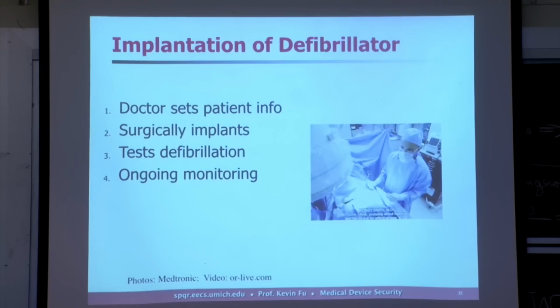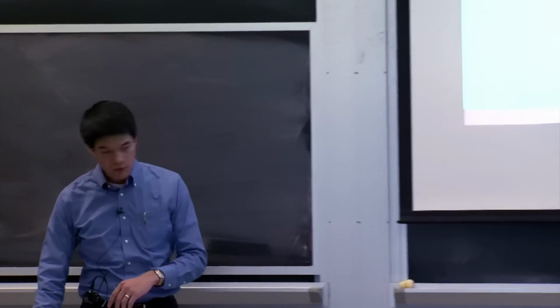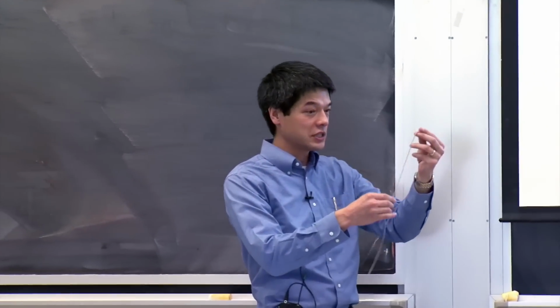A small incision is made beneath the clavicle, and then the team, typically a team of about 6 people, will weave electrodes through a sacrificed blood vessel that then terminates inside the heart. And actually, I have one of them right here. This was not previously used. You can pass this around.